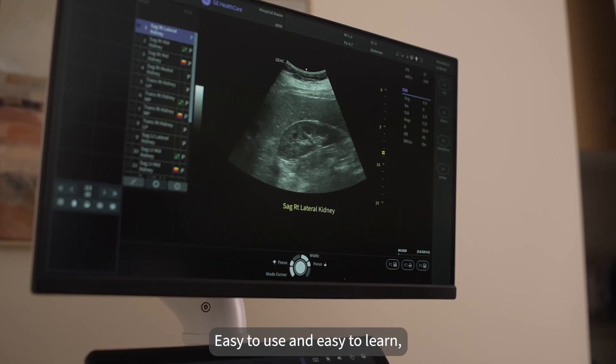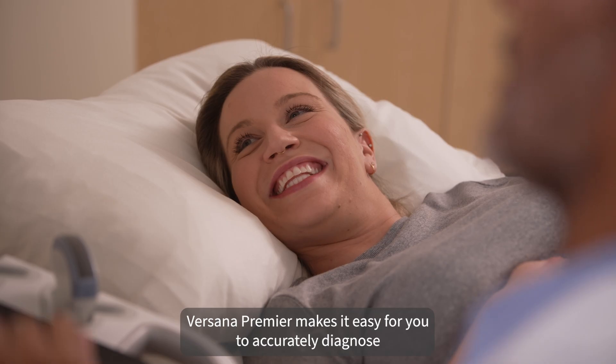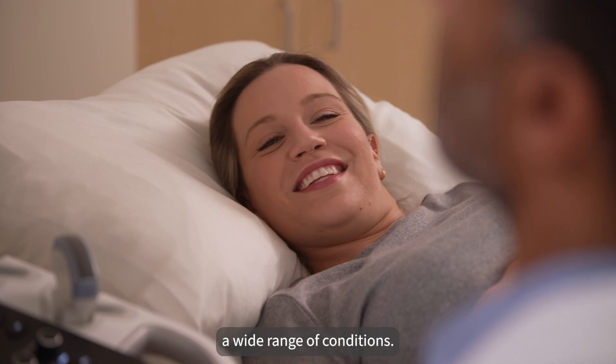Easy to use and easy to learn, Versana Premier makes it easy for you to accurately diagnose a wide range of conditions.